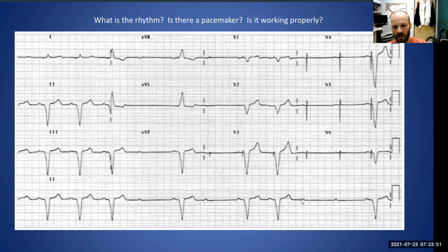So there's no relationship intrinsically between the P waves and the QRS complexes. The pacemaker is appropriately sensing the P waves and delivering a ventricular pacing spike, but the spike isn't always capturing. So rather than second degree, I'd say that this is underlying complete heart block. But otherwise, absolutely right.